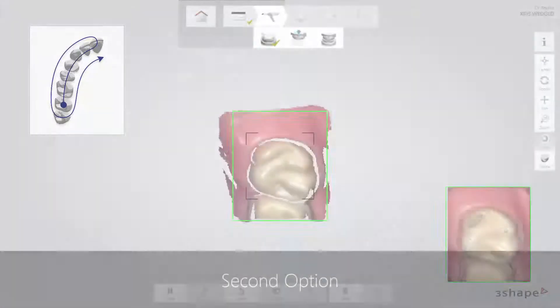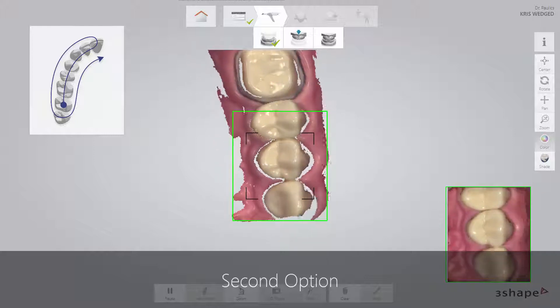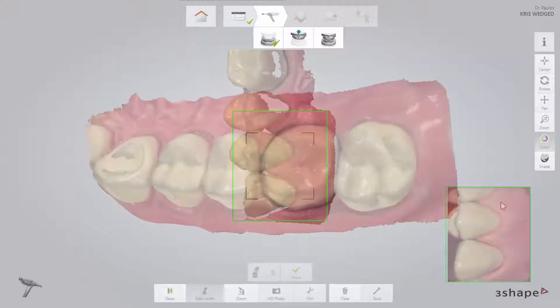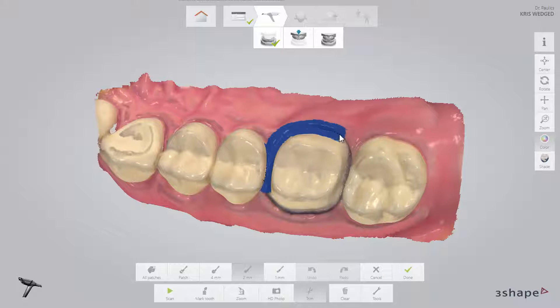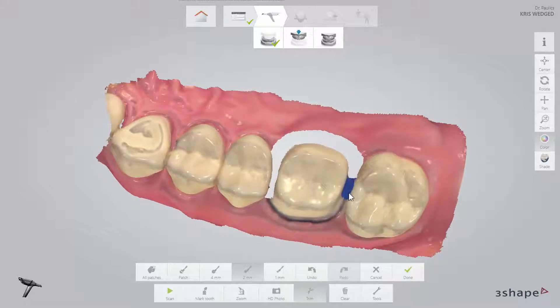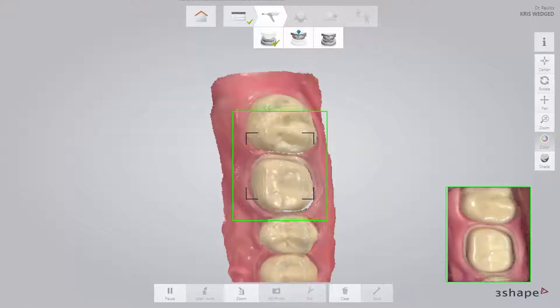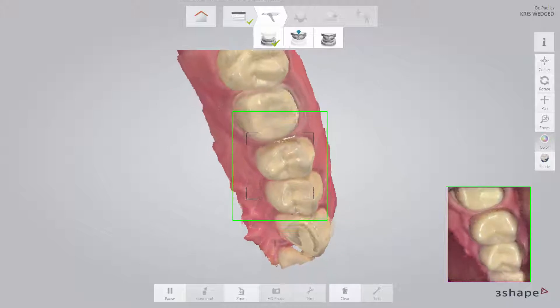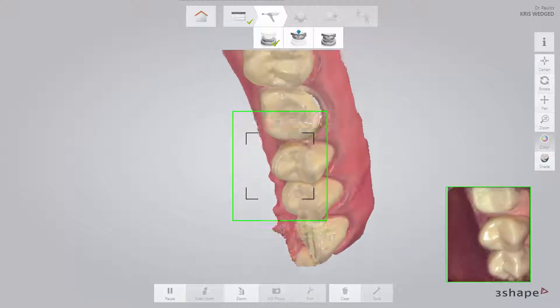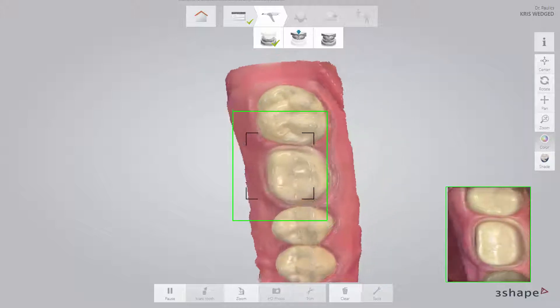The second option is to leave the retraction cord in place and scan the arch following the scan strategy. Then trim away the margin in the scan with the trim tool. Remove the retraction cord, dry the teeth, and scan the margin immediately before the gingiva collapses. No matter which method you prefer, make sure that you cover the prepped area entirely, including the margin line and contact points.